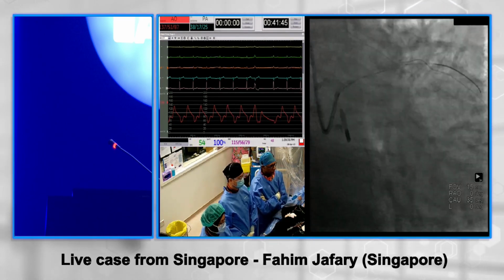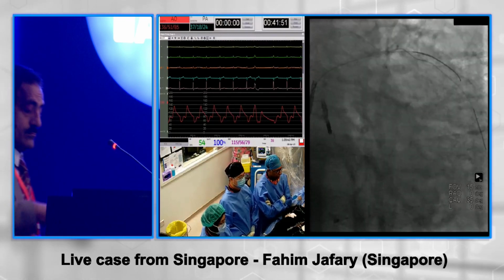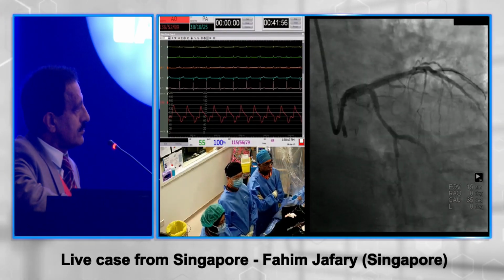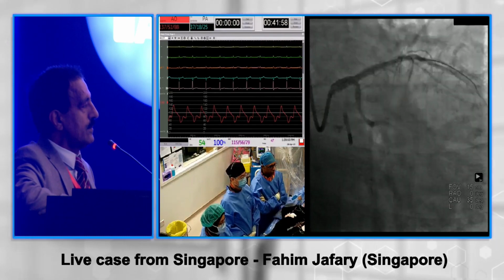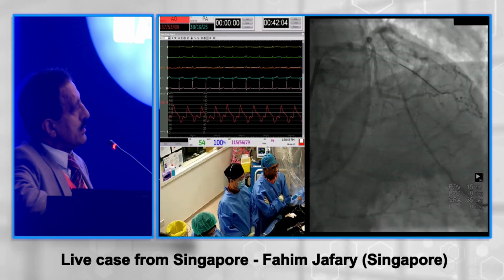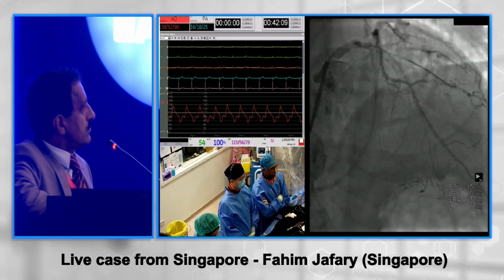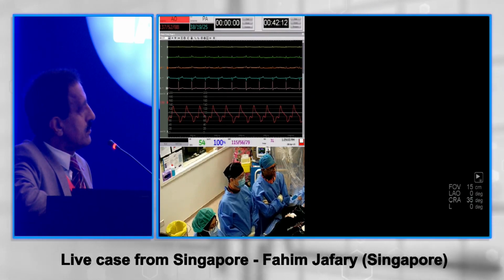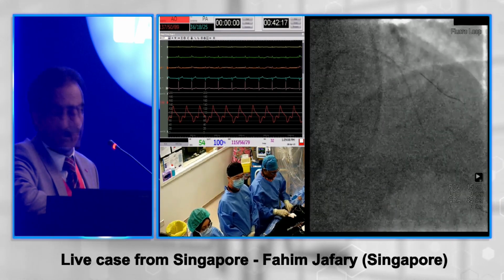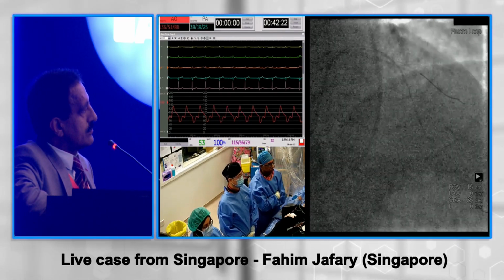And so in the lab, he ended up needing to get intubated, sort of semi-electively, because he started retaining CO2. We thought maybe there was something else going on. So we put in a Swan, and his wedge is only 18, so not bad at all. Next, please, forward. And this is the angiogram after we rewired everything. We put in a Wiggle wire just to get more support. Next, please. And then we re-IVUS. Diana, can you show us the IVUS after rotablation? Okay, so this is the IVUS post-rotablation. I'll just forward it to the areas of calcification.